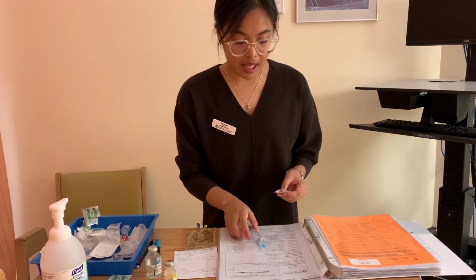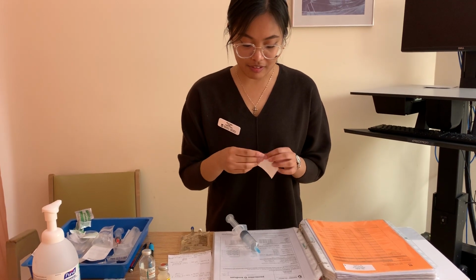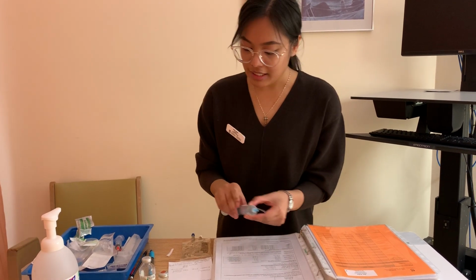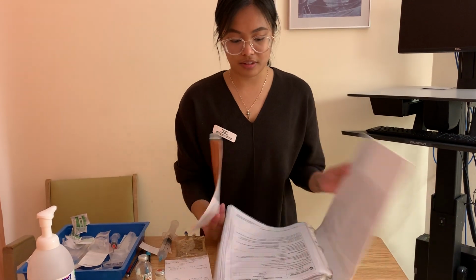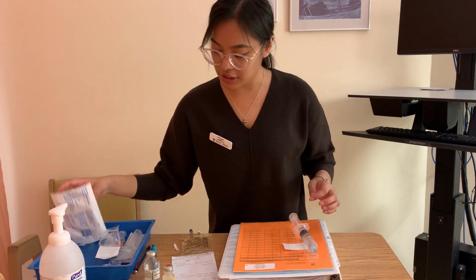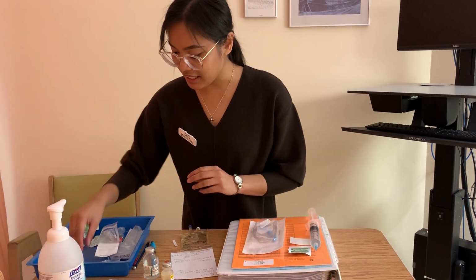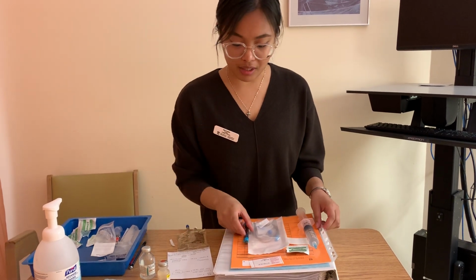So I'm going to put that behind my syringe where it's not covering any of the markings, to ensure that when I put it in the CIVA pump, I know it's running at the right infusion rate. And now I'm going to gather my supplies. So I have here my MAR, my syringe. I also have my secondary tubing mini, and I'm also going to grab some alcohol swabs. I also have my tape with me for my IV tape and a pen for writing on my MAR.